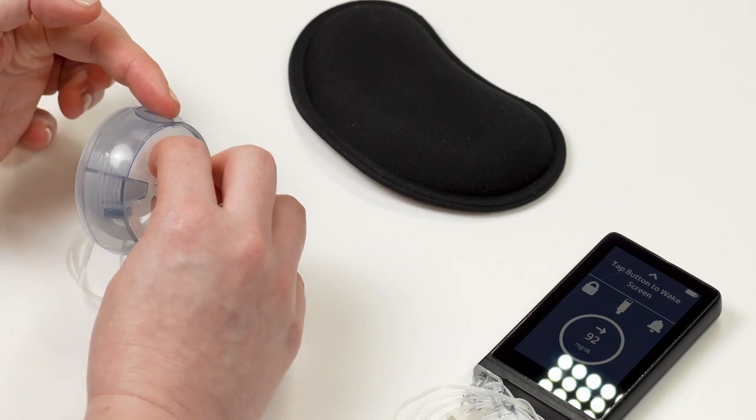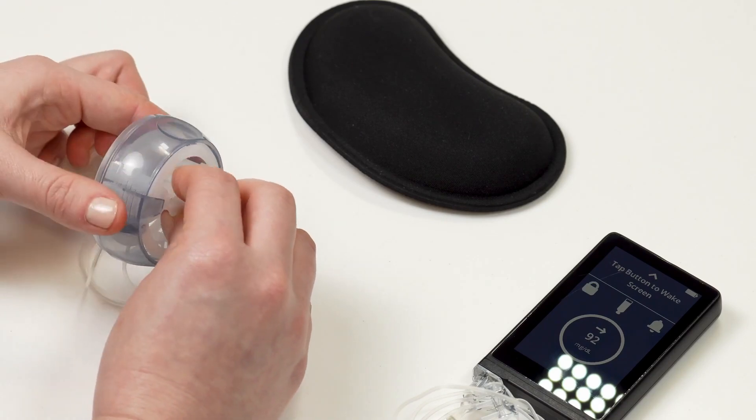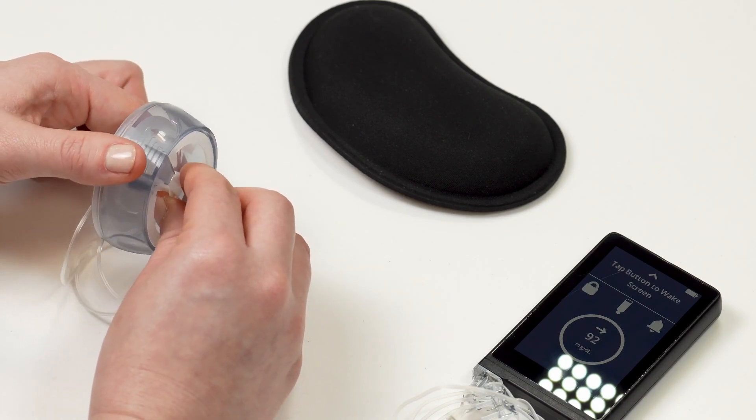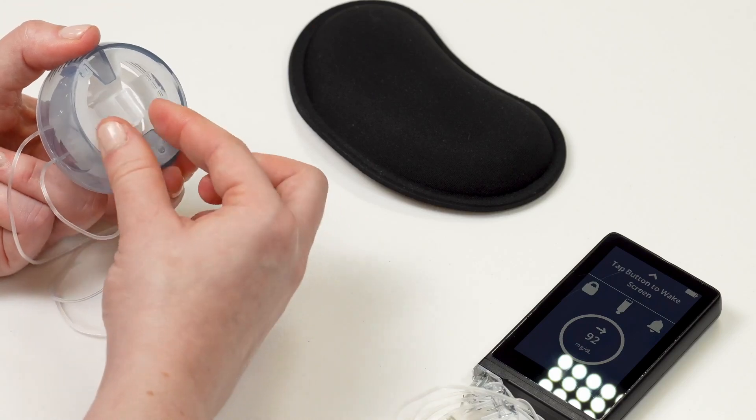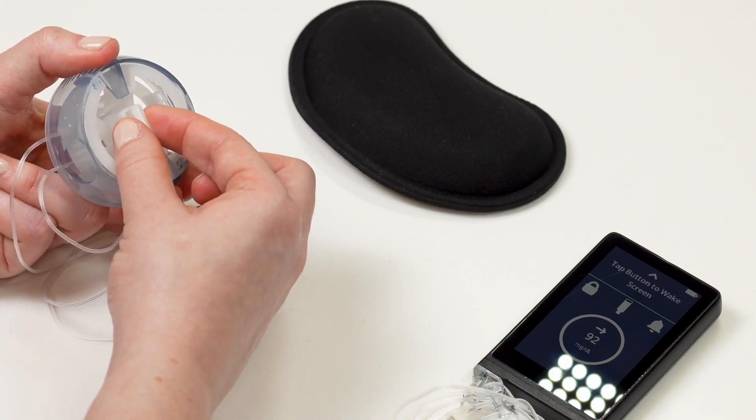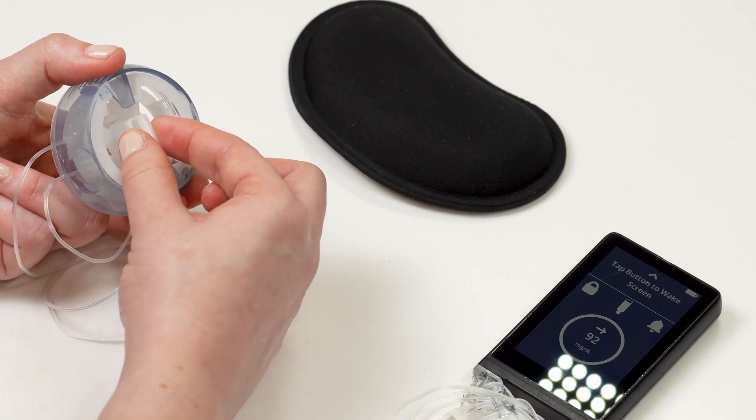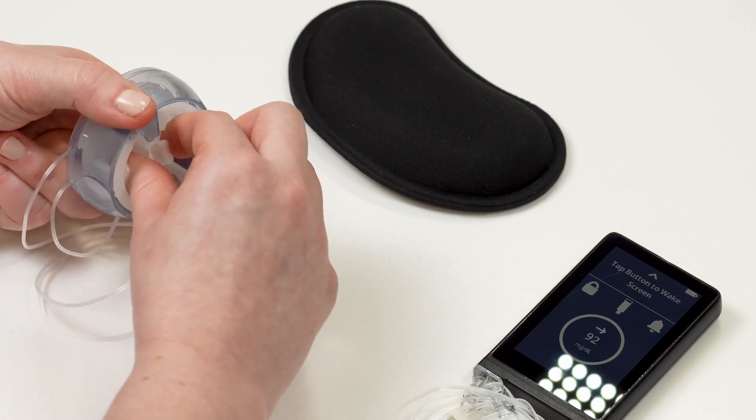The outside of your infusion set has two spots with ridges and two spots with circles. Putting your fingers on the ridges, pull backwards on the white handle of the inserter on the back of your infusion set. Pull this backwards until it clicks.